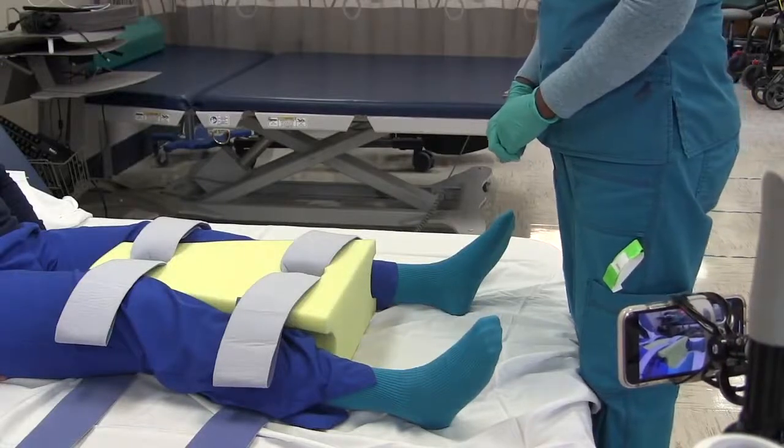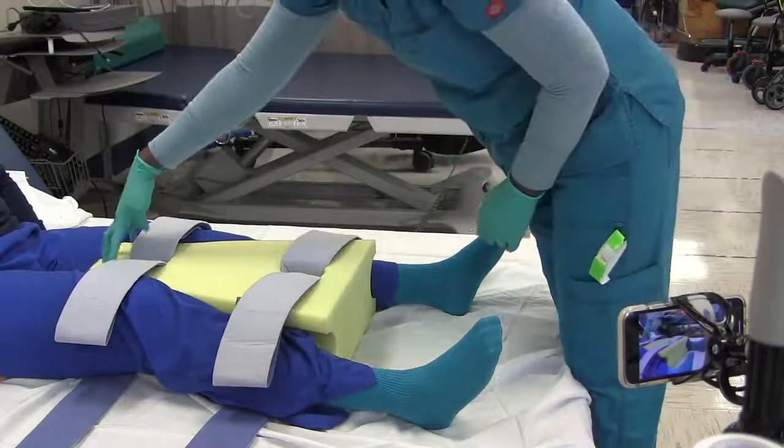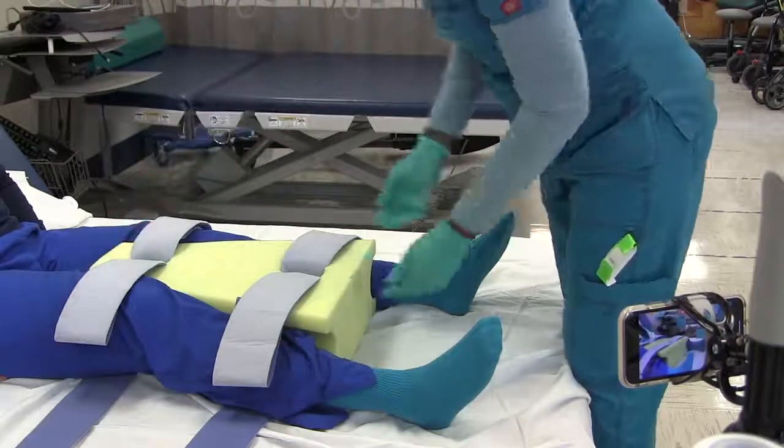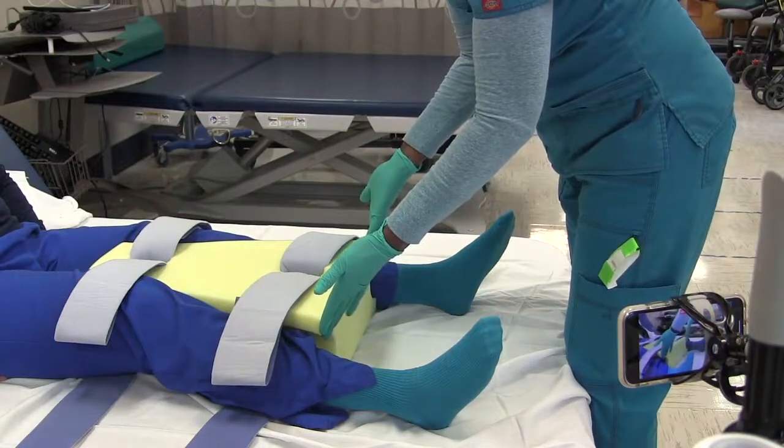This is a hip abduction pillow commonly used with patients with a total hip replacement. The narrower edge goes at the top of the thigh and the broader end goes at the bottom toward the ankles.